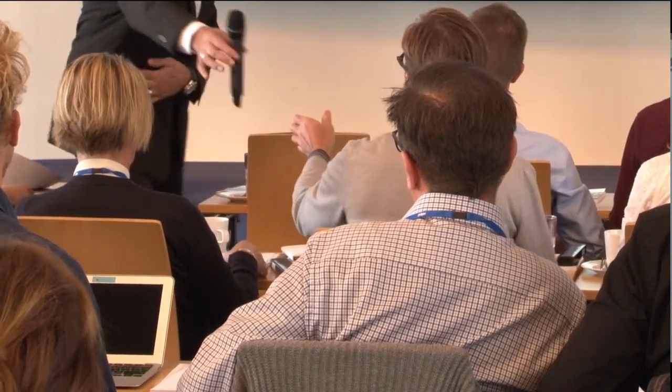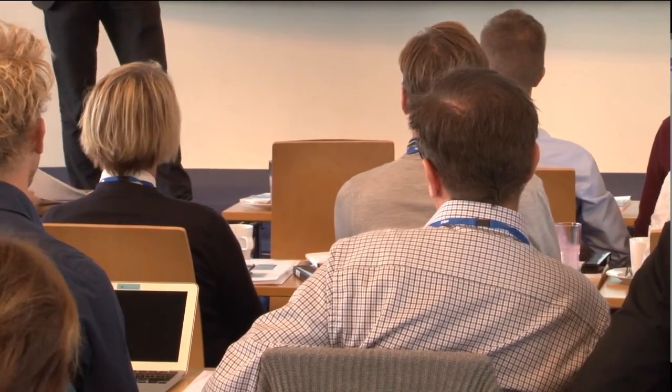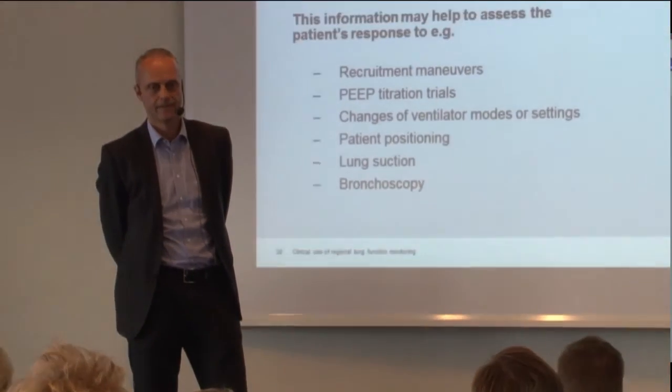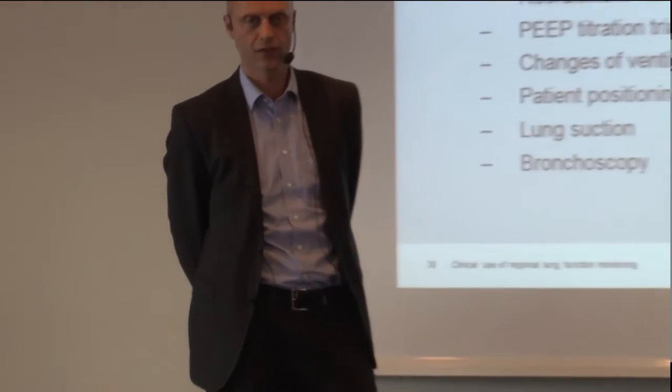So if I understand it correctly, all these values are relative values. Yes. So there are no data from the respirator, volume or pressure data from the respirator. No, it can actually be used without any connection to a ventilator or flow meter. It's based on the fact that the increase of impedance is quite linear to the increase of lung volume.